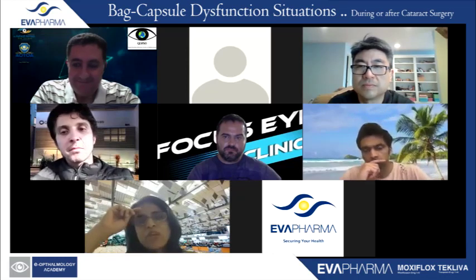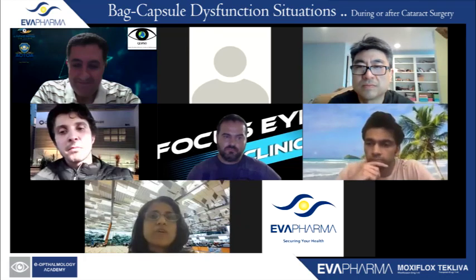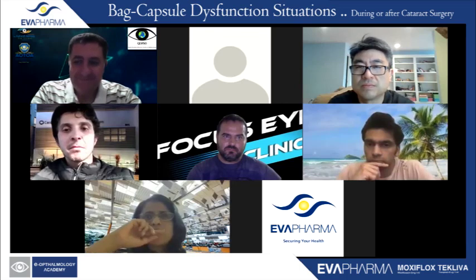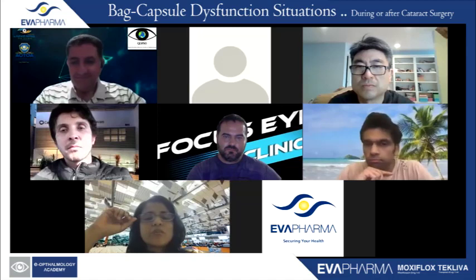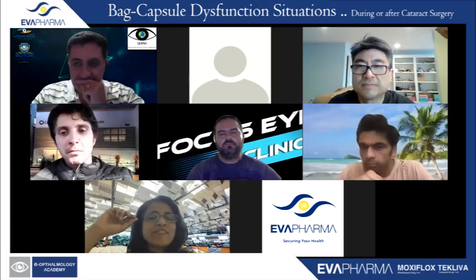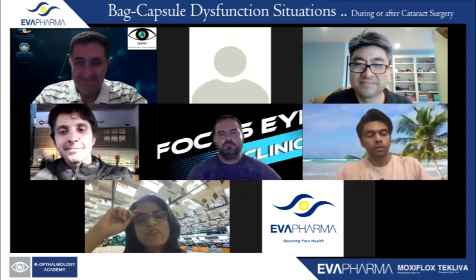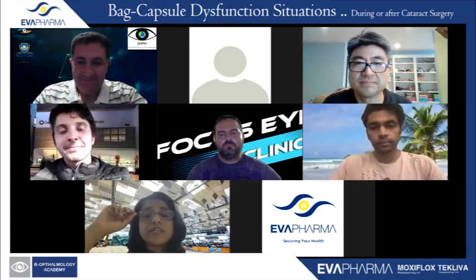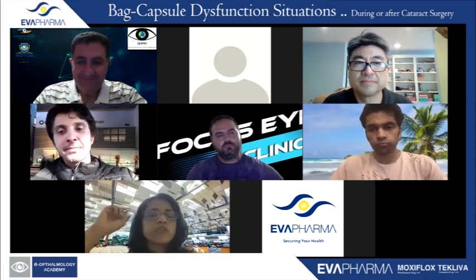But then, you know, I kept working on this thing and fine tuning it. And then I started working with Morcher, and that's the paperclip capsule stabilizer, the present version. And I'm also working with them on developing some more things. But unfortunately, this is a question which I'm sure Sergio also gets everywhere, and I also get everywhere, is it available in the US? And unfortunately, this is something that probably both of us would love to be available in the US and all over the world, but there are too many regulations, not only in the US, in other countries as well, which unfortunately is sad, because these are beautiful techniques of bag fixation.